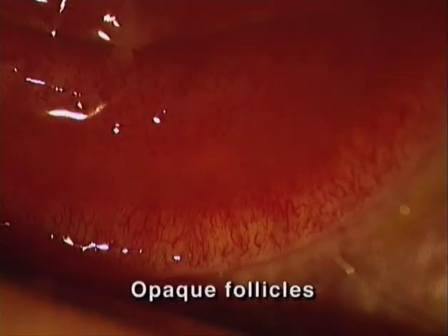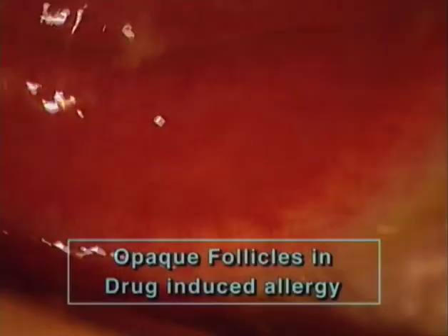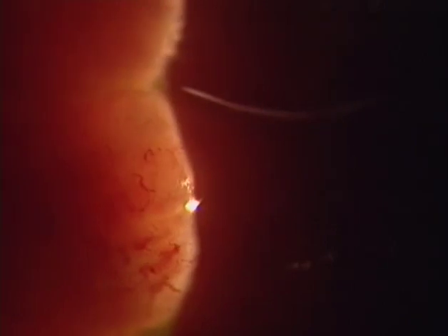Opaque follicles. This is another case in which the follicles are difficult to make out, because they are opaque as well as hyperemic. Nevertheless, when using the narrow slit light, the globular protrusions of the surface can be made out clearly. And when examining in indirect lateral illumination, we can identify the translucency of the central mass and the fine superficial network of the capillaries.